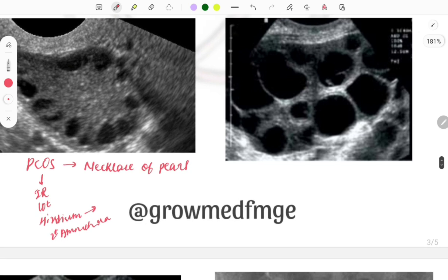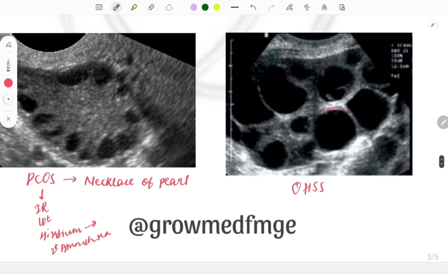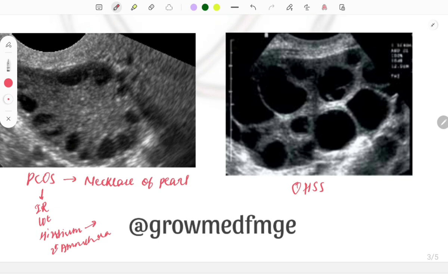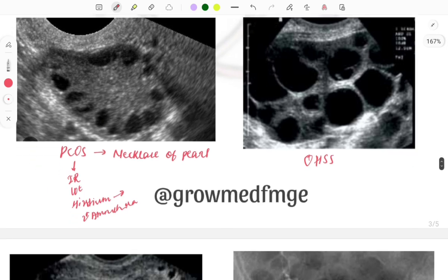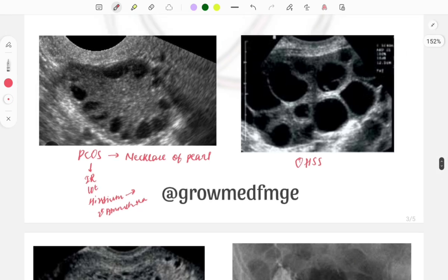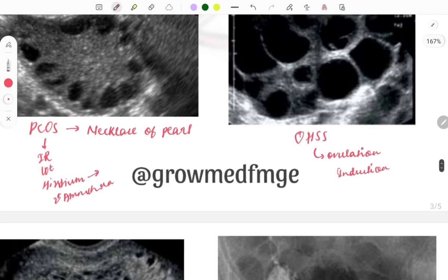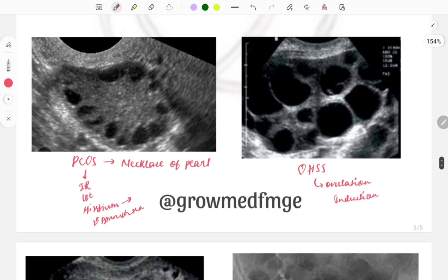The next image is of ovarian hyperstimulation syndrome — this is also an ovary but the follicles are of much greater size. When these rupture, estrogen is released into the blood, causing third-space fluid collection, edema, and swelling. This is most commonly associated with ovulation induction for infertility or IVF treatment.